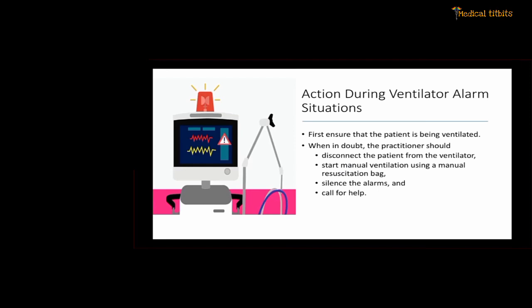Sometimes there will be a malfunctioning of the equipment as such, which might require your hospital biomedical engineer or technician to come onto the scene, and probably it might require service or major interventions. In such a case, you keep the ventilation going using a manual resuscitation bag and try to get a different mechanical ventilator for your particular patient.